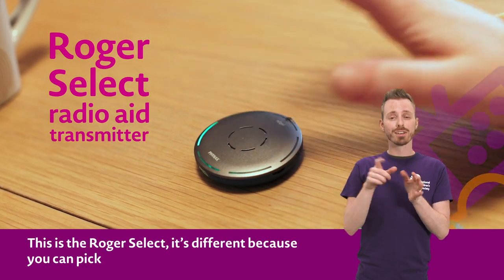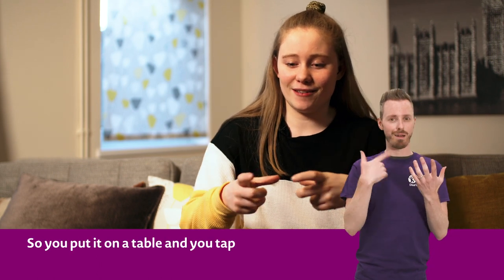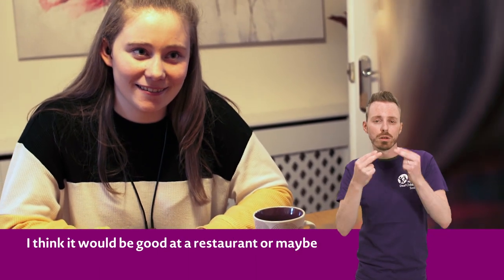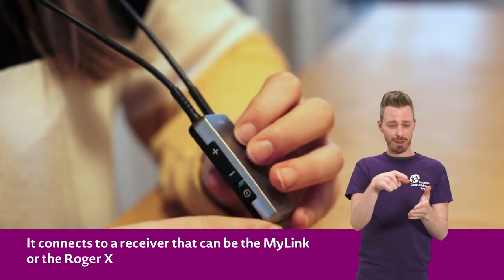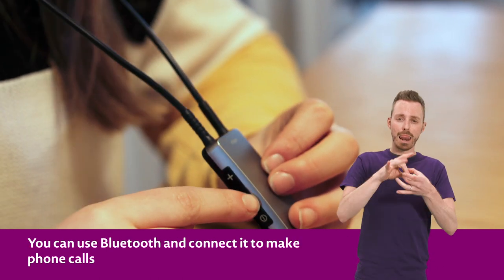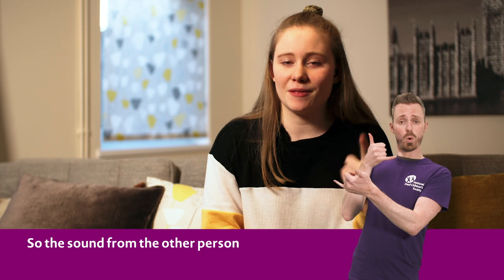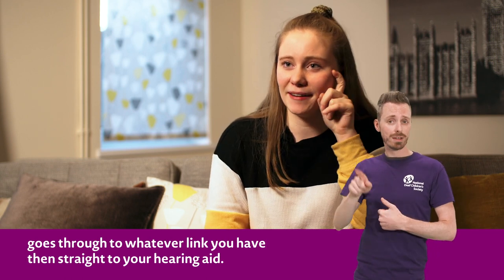This is the Roger Select. It's different because you can pick where you want the sound from. You put it on a table and then you tap to select where you want to hear from. I think it would be good at a restaurant or maybe in group work at school. It connects to a receiver, so it could be the MyLink or the RogerX at the bottom of your hearing aids. You can also use Bluetooth to make and answer phone calls — the sound from the other person goes through to whatever link you have and then straight to your hearing aids.